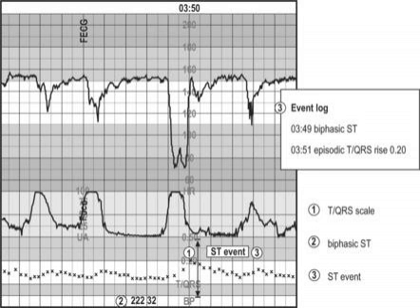In any case, they randomized 1,010 women into either standard care with electronic fetal monitoring or to the addition of the fetal pulse ox if warranted. They categorized the fetal heart rate tracings into 3 groups, which are very similar to the NICHD guidelines that we talked about in the last episode. Category 1 was allowed to labor without using the pulse ox. Category 3 was considered ominous, and the fetus was delivered without further intervention in either group. And so what we're really talking about here is the Category 2 tracings. This, again, is good study design because it's exactly the babies that we're worried about.